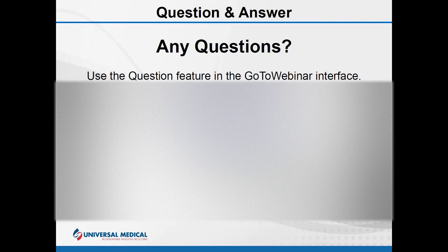Plus that, the other thing to consider again is that the patient gets injected before he ever came into that room. He's going to be in there the whole time, and when he leaves, he's carrying the radiation with him. You're in there for half an hour while he's in there. So the amount of time exposure is significantly reduced compared to what he's getting. You add the 1/256 to, let's see here, half an hour would be 1/120th of the time. Again, things add up in a positive fashion for us as service engineers.